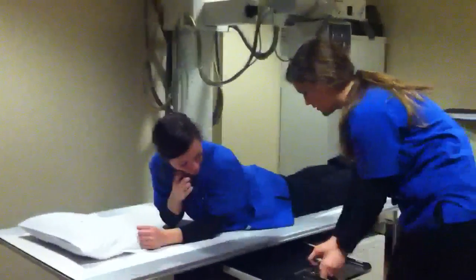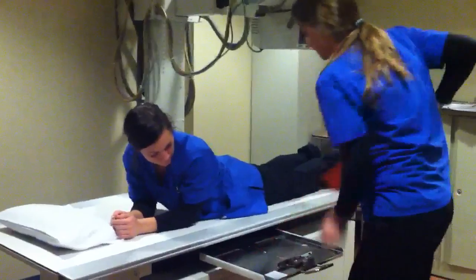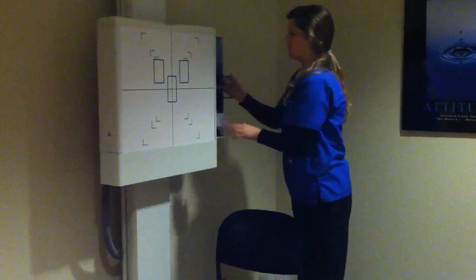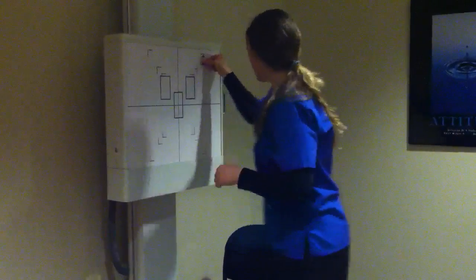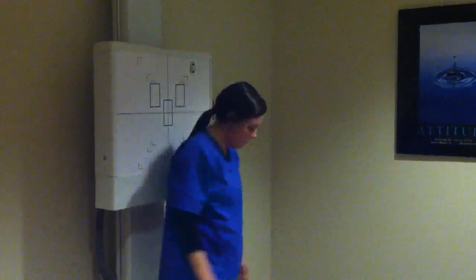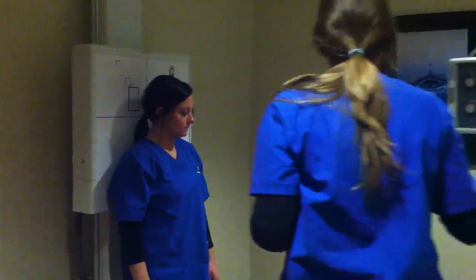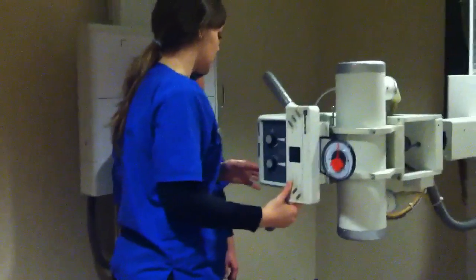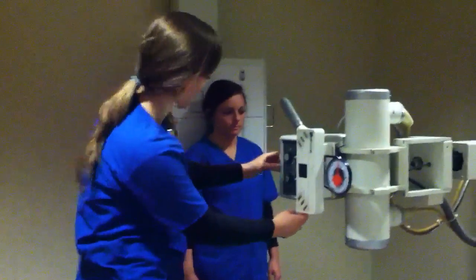Take this off first. Put my 14 by 17 cassette lengthwise upright in the bucky. Left marker on the left side. Let's try to get this out of the way. All right, you can just stand and put your back up against there. An upright abdomen is not part of the usual small bowel follow-through protocol, but it is usual that patients with abdomen complaints will receive an upright abdomen.